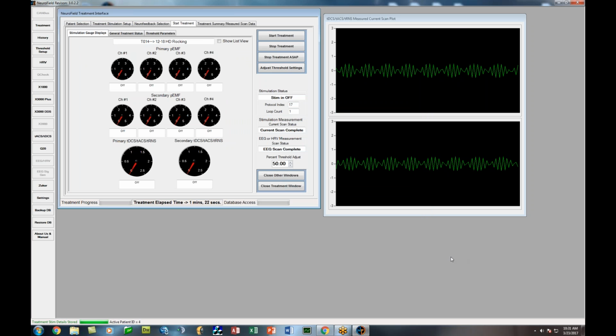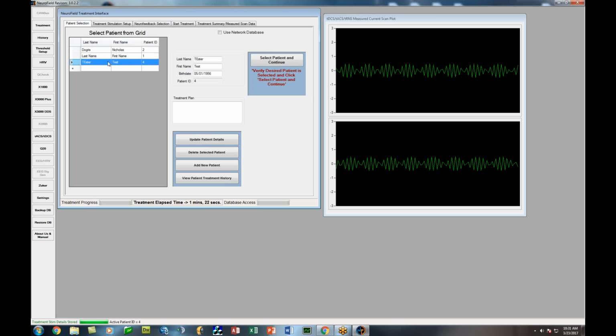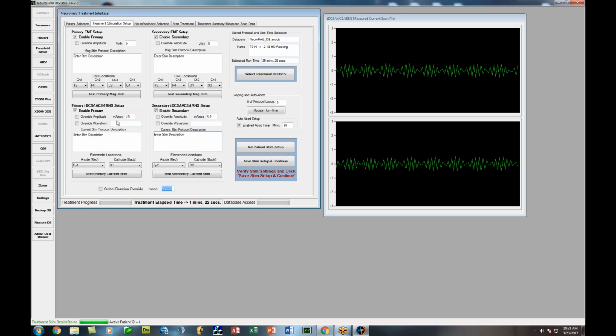All right, so I just ran you through what's called the stim-only procedure. Now, let's say you wanted to do a dehabituation on a person. So let's make this guy go over here. I'm going to go back to patient selection. I have my patients selected, and let's say I go, well, I really want to run a dehab on a person. Actually, before I do that, I'm going to do something else here.